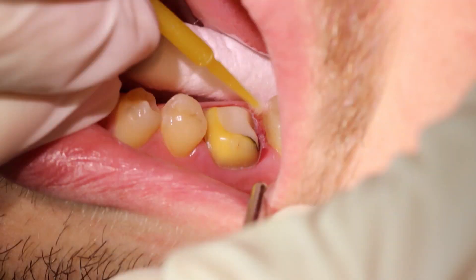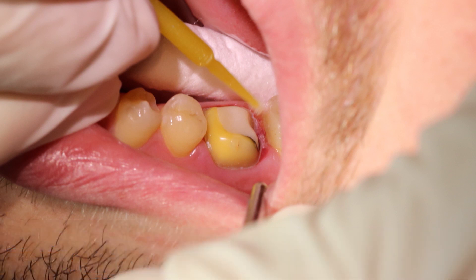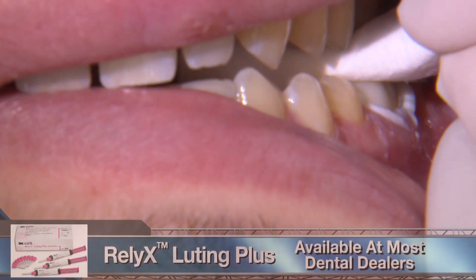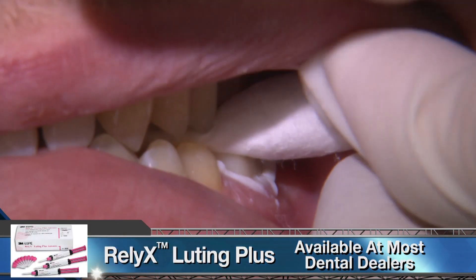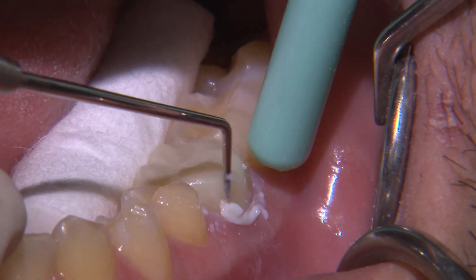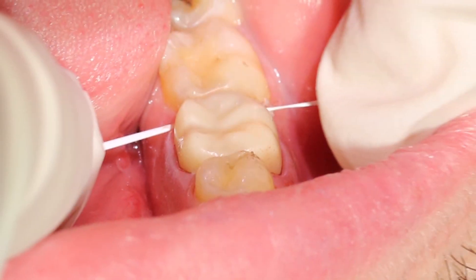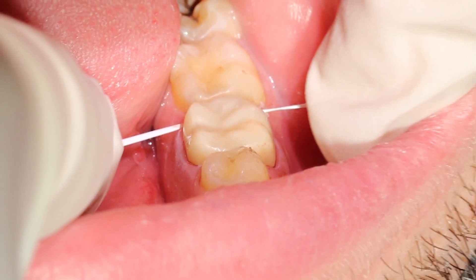I scrub a small amount of Gluma onto the prep to help disinfect and clean the surface, and if the tooth was vital, it would also help with desensitizing. I cement the crown with 3M's Relyx Luting Plus, which is their resin-modified glass ionomer cement. After about two minutes, the cement enters its gel state and makes removal of excess pretty easy.